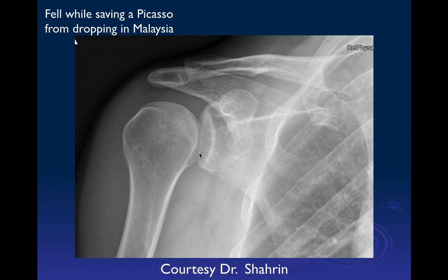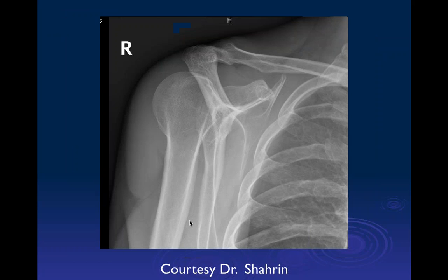So what does that make you concerned about? I'd want to correlate with history of posterior dislocation. Okay. This is like a reverse Hill-Sachs deformity. Yeah. And here's the Y view, close to it, not quite. We're not seeing the humeral head centered properly on the glenoid. It's not quite the right view. And we can see that the articulating surface of the humeral head really isn't pointed over here toward the glenoid. So this would also make us very concerned that this patient is dislocated.